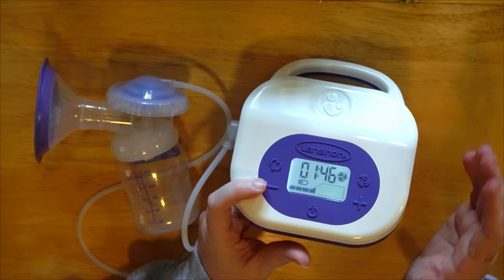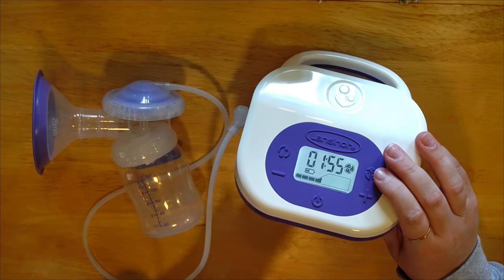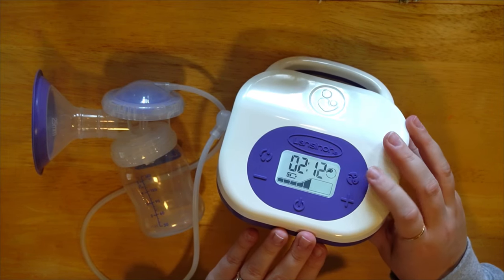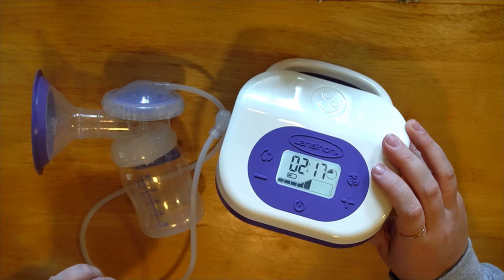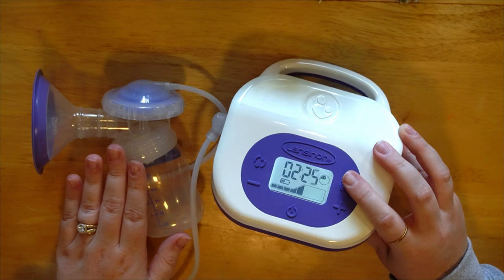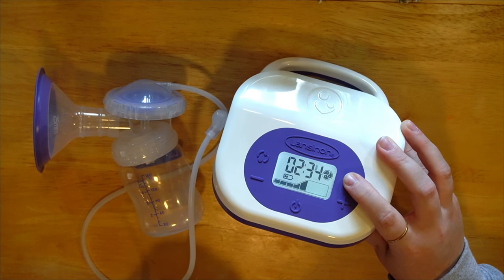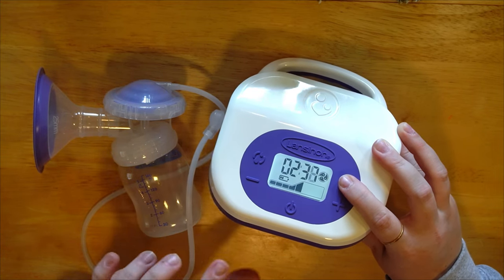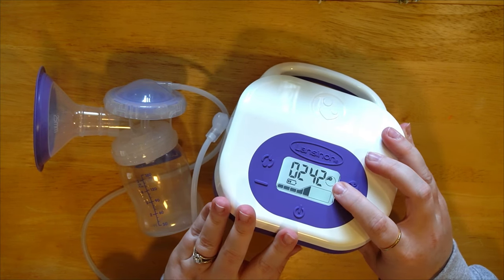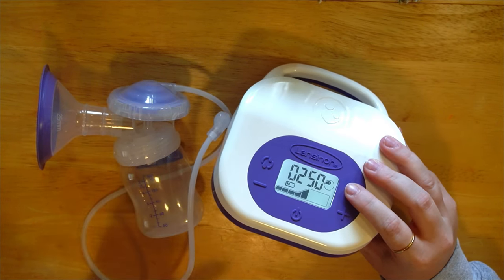Frequency is equally as important as suction. On the third option you can hear how infrequent the cycles are. I myself was always on the first option — that high frequency worked great for me. The second is a bit more drawn out, and the third is much more drawn out. Like everything else it's completely individual. I'd suggest starting on the lowest frequency first, since chances are it won't cause any irritation, and then slowly increase from there.